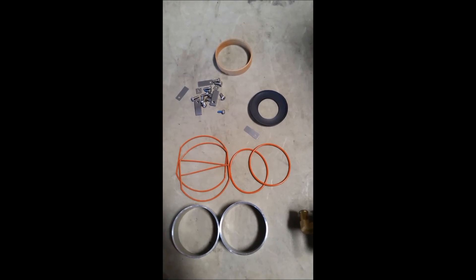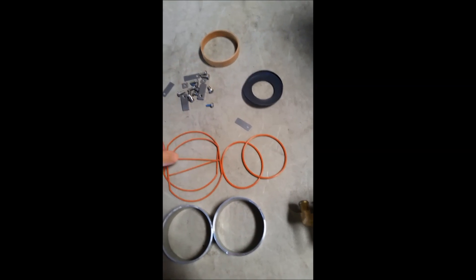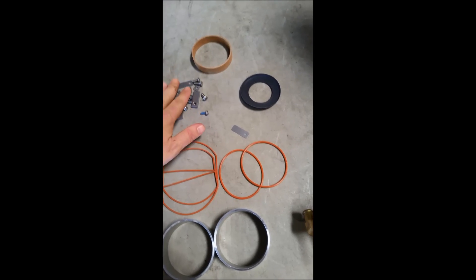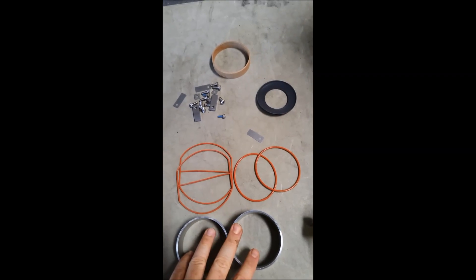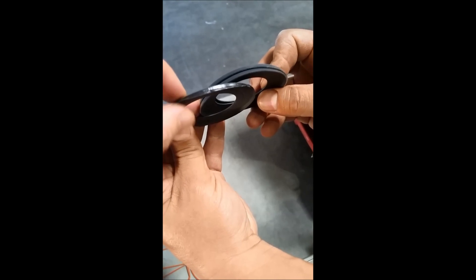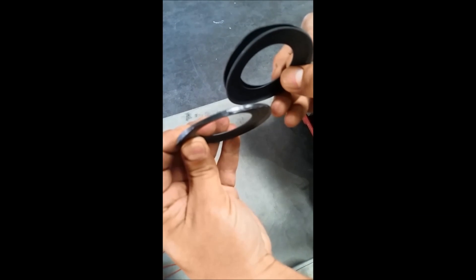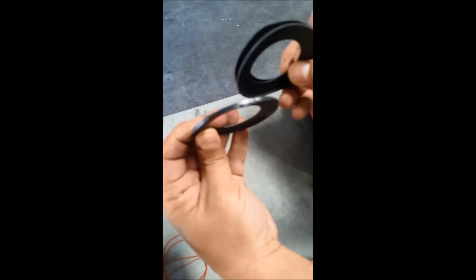Here's the concentrator rebuild kit with all the parts laid out — some new gaskets, new seals, and screws as well as the heads that you're replacing. You can see how silvery and worn out the old one is, really paper thin compared to how nice and rubbery the new one is. That gap between the two is what's causing the noise.